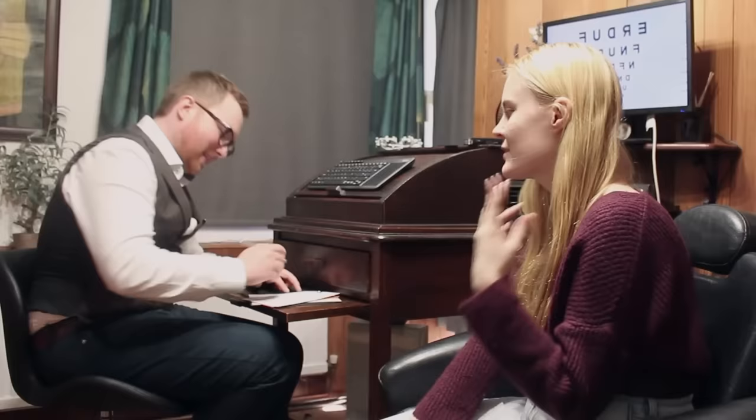Okay, no, that's fine. So, importantly, do you ever get any headaches or any eye aches when you're using a computer or doing close work at all? Yes, yeah. But I can't always tell if my headaches are from using the computer or from other things or stress. Okay. I also recently cut out caffeine, which probably doesn't help. That was a challenge. Yeah.